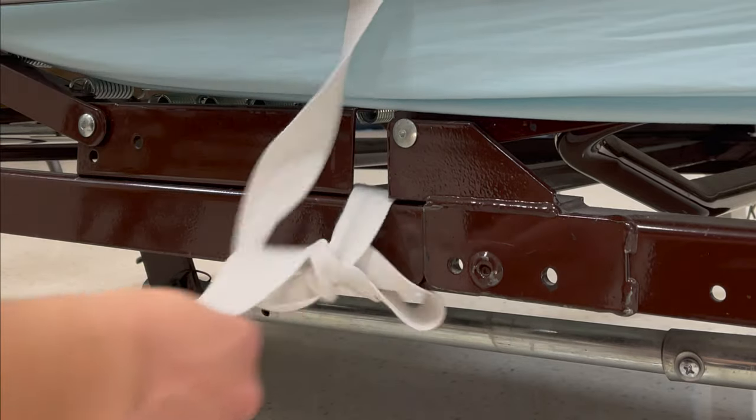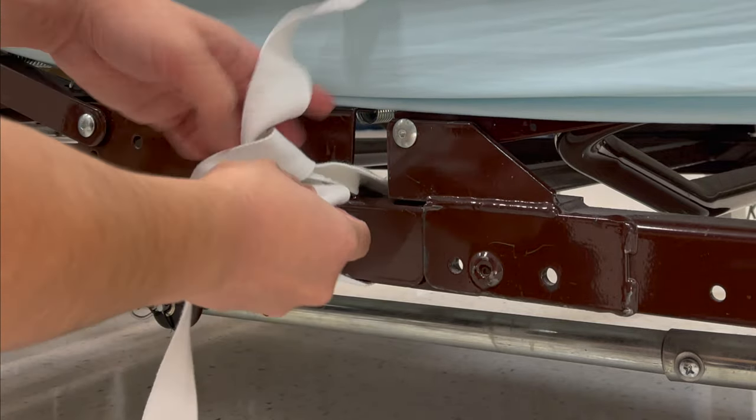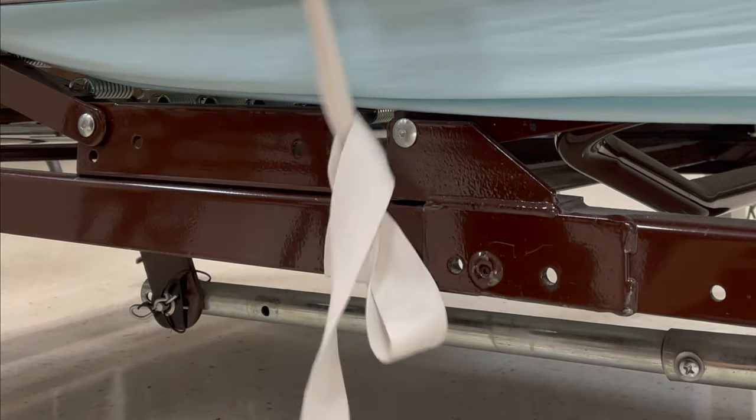Make sure that you can release the tie with one pull. Make sure to put the restraint on the bed frame.